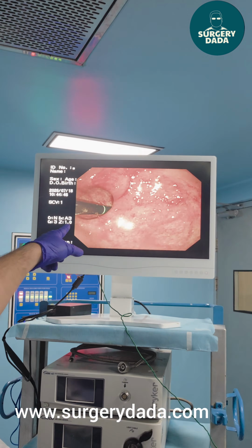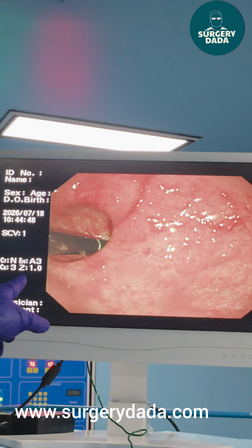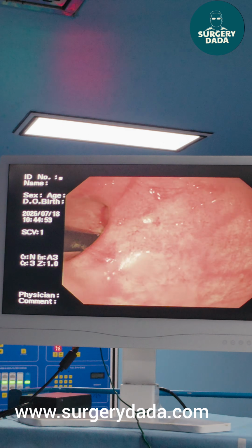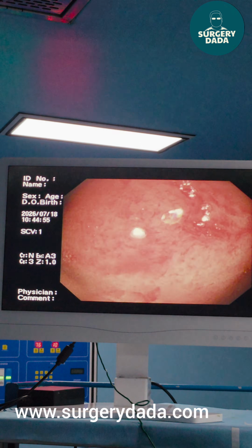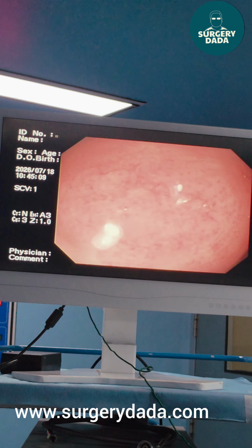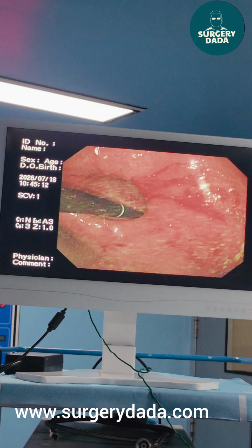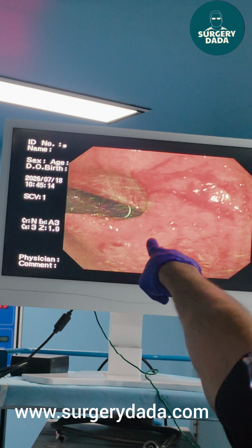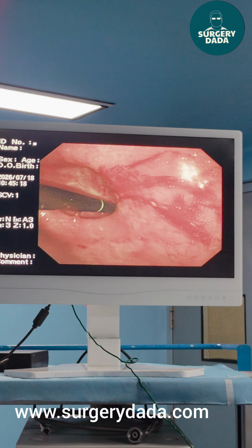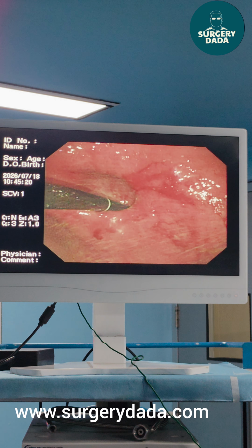Now you can see on the J maneuver, this is a classical sliding hernia, but the stomach has gone. And can you take it more inside? The location of the stricture. Okay. This is the stricture. So this is the dilatation, and we need to do a stricturoplasty for this patient.